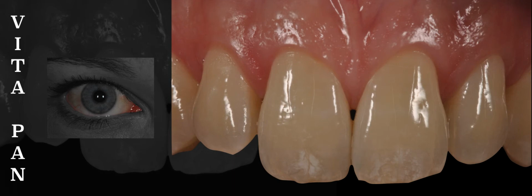One of the best tips I can give you is to use statistics to your benefit. In a recent data analysis done by Glidewell Laboratories, 80% of single unit crowns are in the A shade range and only 20% for all the other shades. So, if you are trying to restore a single anterior tooth with composite, those 5 to 10 seconds, use them to see what A range do you think your tooth is in before you even select a shade tab.